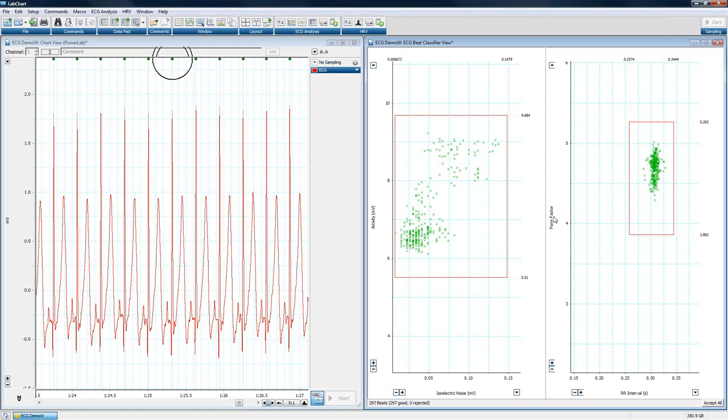Okay, we're recording from this rabbit, but it's not conforming to a known good rabbit ECG form for lead 1. It's looking a little off from it.